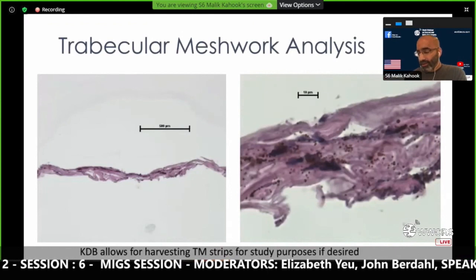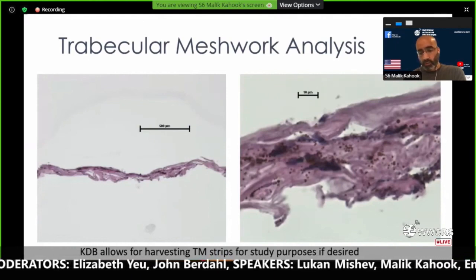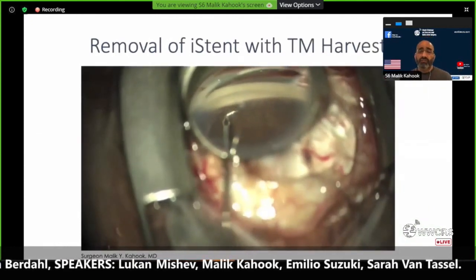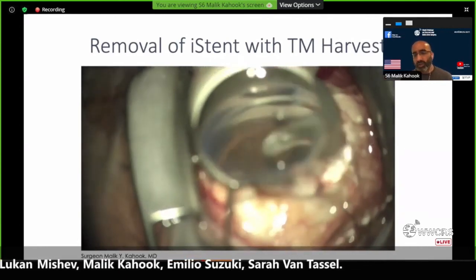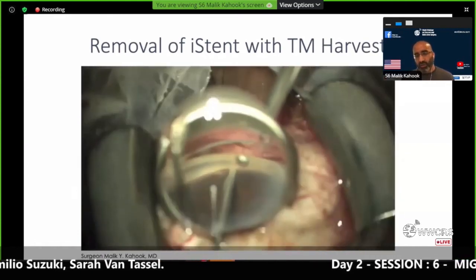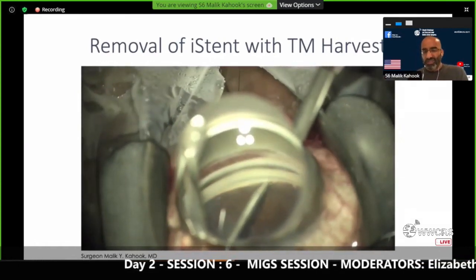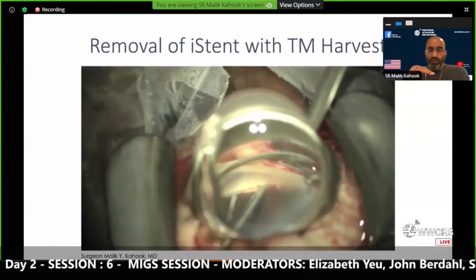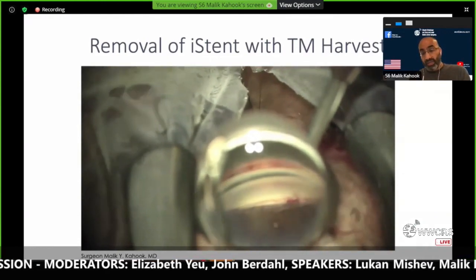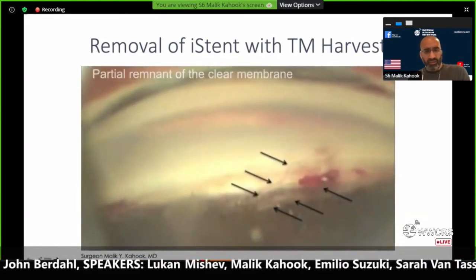If you like looking at trabecular meshwork and trying to figure out what's happening with glaucoma, this is one of the rewards from doing excisional goniotomy. We can take the trabecular meshwork and see what different devices are doing in the angle—we can see the pathophysiology of glaucoma in a way we couldn't before. This is a case of an I-STENT I had done two years prior. I noticed a film growing over the I-STENT, pushing it down, so we went in, removed the I-STENT, and did an excisional goniotomy. Towards the end I could feel resistance, and you can see a film that was actually growing over the device—right there, you can see the film to the right-hand side. We collected the tissue and took it to the lab for histology.